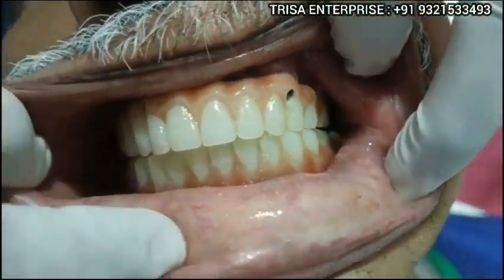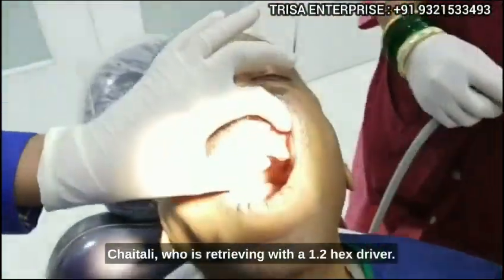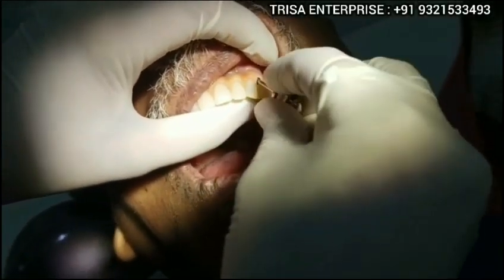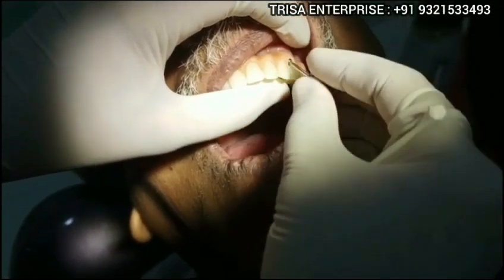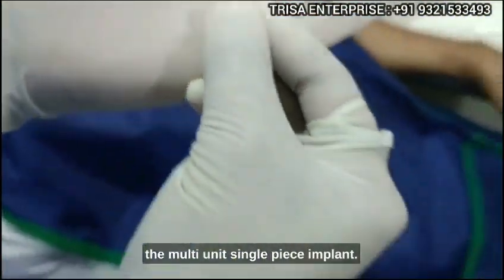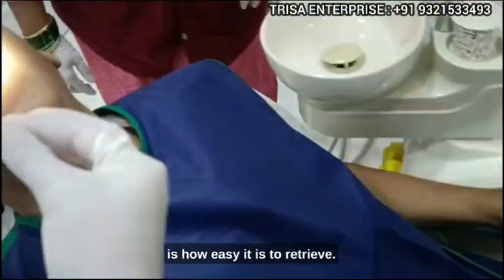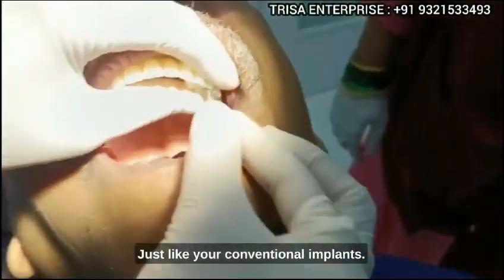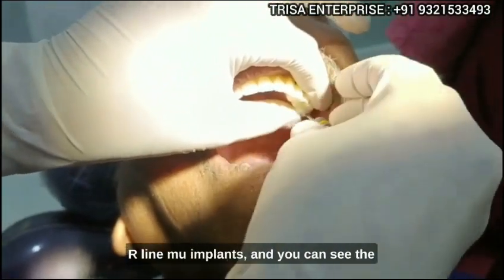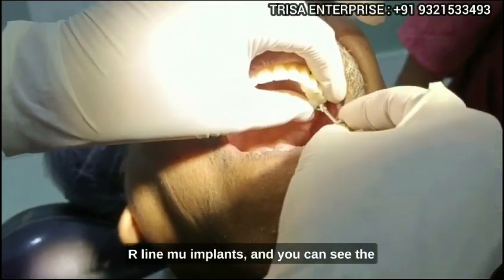Right now we want to retrieve it for oral hygiene maintenance. Mind you, this is all in immediate load protocol. Please show the retrievability — just open up one or two screws. We have with us Dr. Chaitali, who is retrieving with a 1.2 hex driver. This is the screw of the multi-unit single-piece implant. We have retrieved a few already, and this is how easy it is to retrieve — just like your conventional implants. We are retrieving all the screw-retained single-piece R-line MU implants.